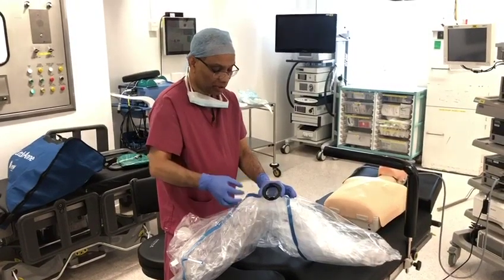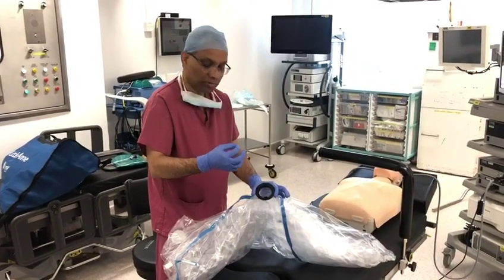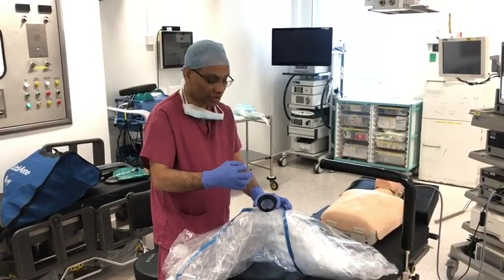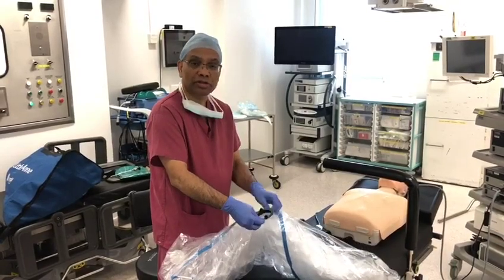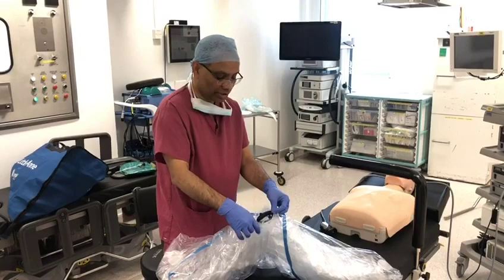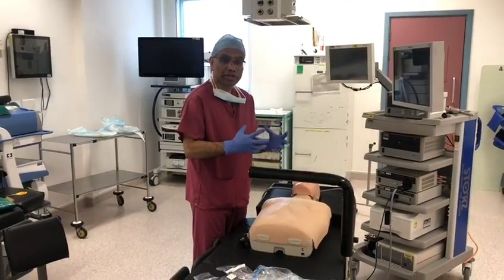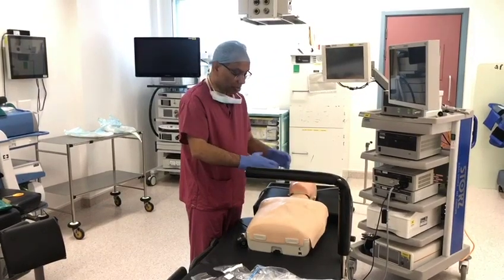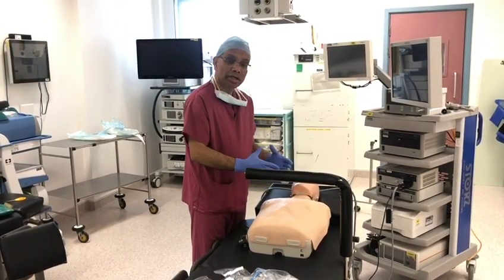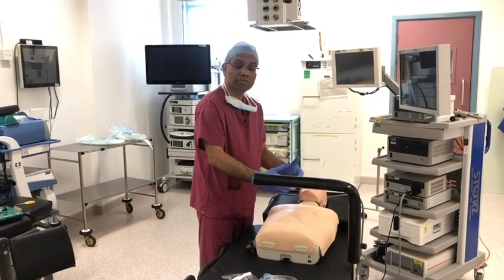Once we remove the lens cap, you can feed the bipolar, then micro-debrider and suction through that and then flip it around, so that creates a seal around all these cables. All the required instruments can be placed inside this tent on a magnetic mat, which can be placed on the patient's chest.